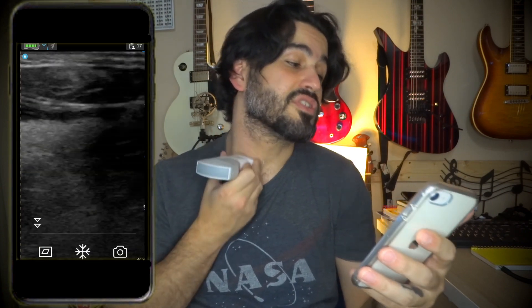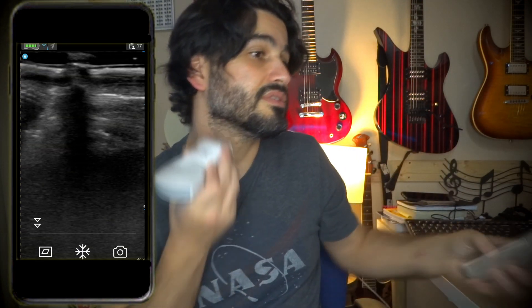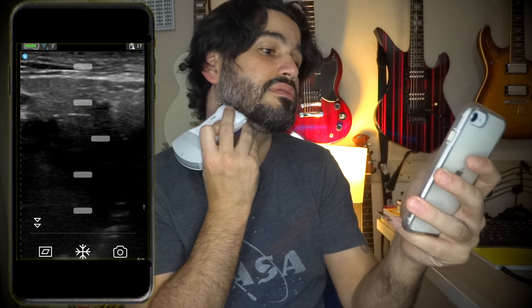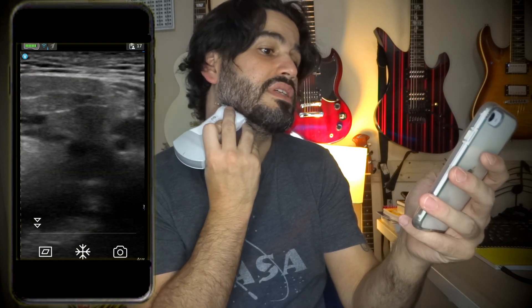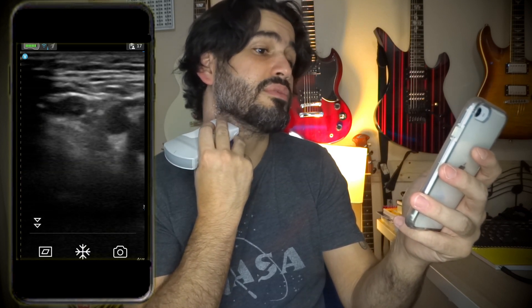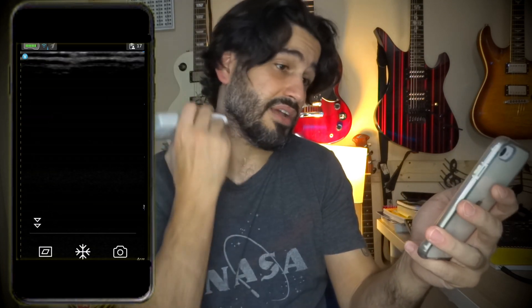Let's see if I can see my submandibular gland — just go up here, put the TGCs a little higher. Nice! I might do a neck level video for lymph nodes. I'm going to do a venous Doppler protocol and share the cases I already have. I'll be doing a lot of videos with this until I have to give it back.